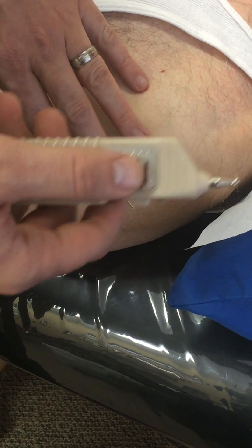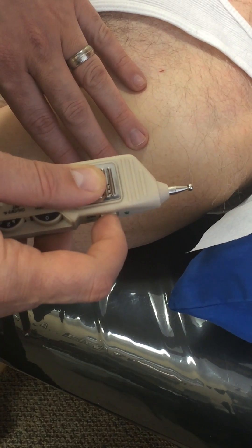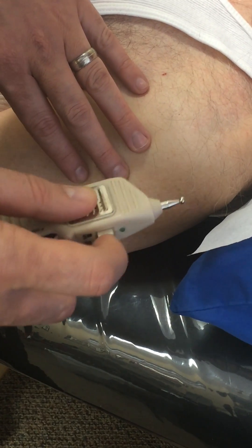For my right hand, my thumb will go on the metal plate, and this is the button which ignites the Pointer Plus. You can see that the light comes on. This is the best and most comfortable position to use.